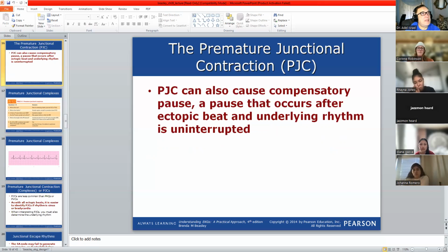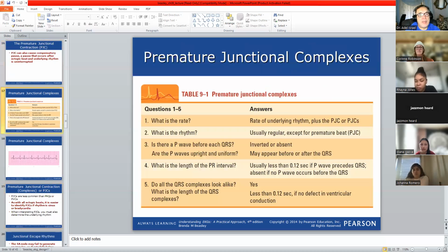Okay, let us have a strip to make our understanding, and this is like the slides. I need everyone to review the slides. Read the slides carefully.